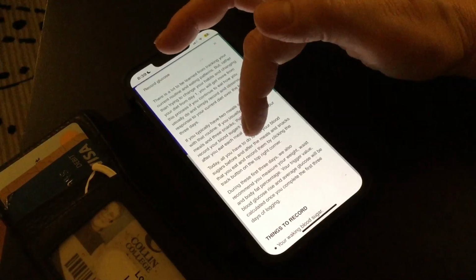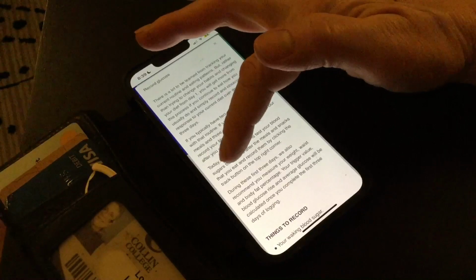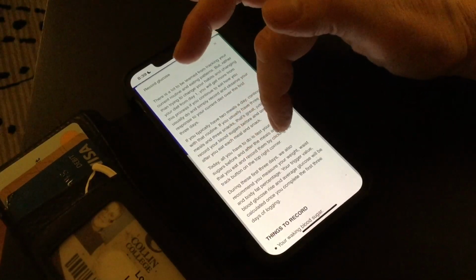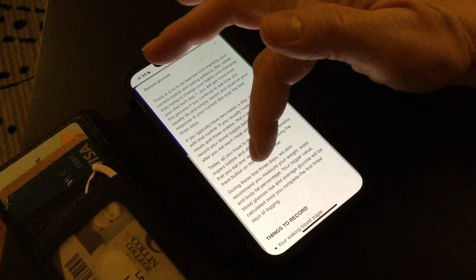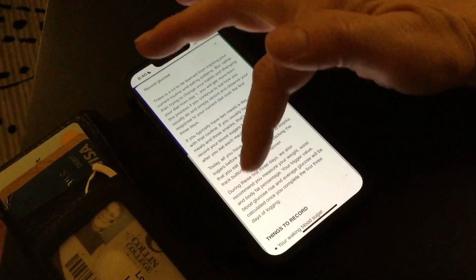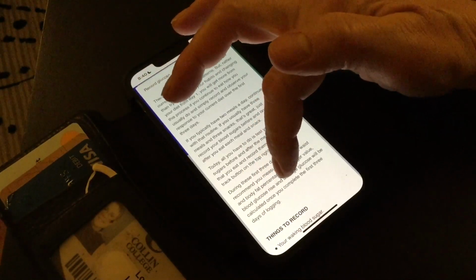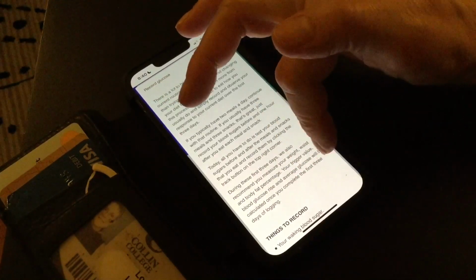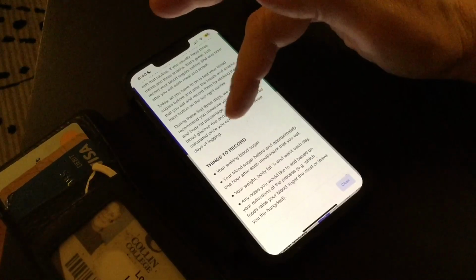Today, all you have to do is test your blood sugars before and after the meals and snacks that you eat and record them by clicking the track button on the top right corner of the dashboard. During these first 3 days, we also recommend you measure your weight, waist, and body fat percentage. Your trigger value, blood glucose rise, and average glucose will be calculated once you complete the first 3 days of logging. And then down here is just the things to record today.